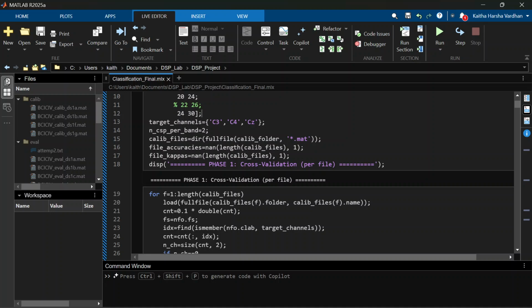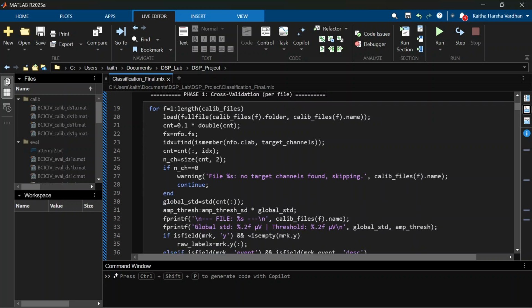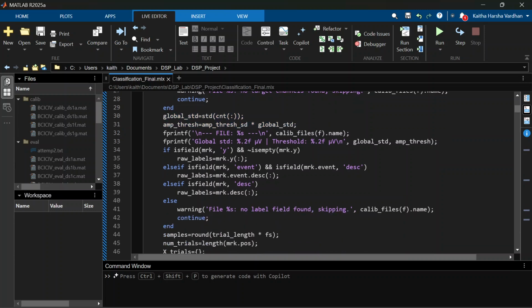Basically, we load the files in the .mat format, and after loading, in this part we check for the channels C3 and C4, because that dataset contains a lot of channels, but we are interested only in the C3 and C4 channels and the CZ. So we extract those channels only. And this is the artifact threshold, where we set the threshold and remove the signal which is more than this.